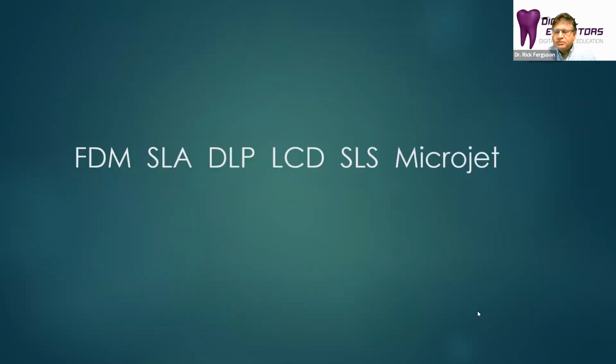So just a quick review of 3D printers. We started off with FDM printers with BlueSkyPlan. The Cell Robox was one that Blue Sky actually was carrying.